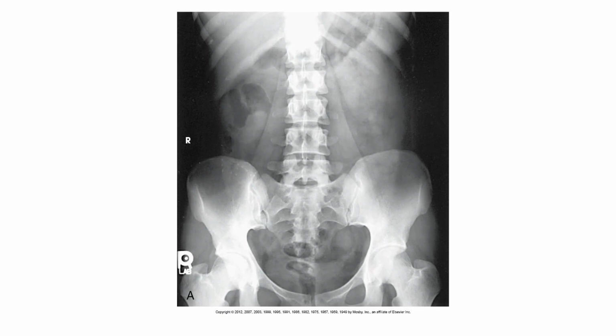Okay. Track back to the middle of the radiograph. Look at the lumbar spine. Okay. And you're going to see some ice cube shapes. Those are vertebral bodies. And then superimposed over that, there's going to be a vertical dashed line of bone. Those are the spinous processes. Okay.